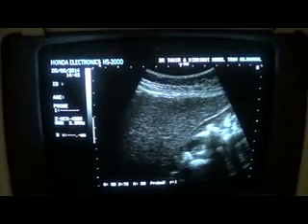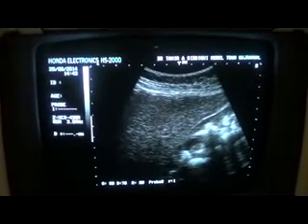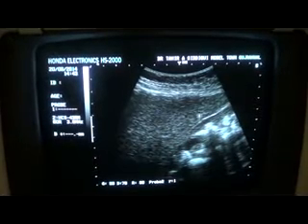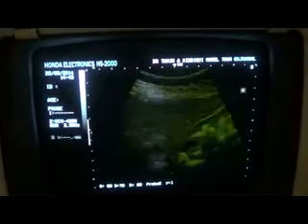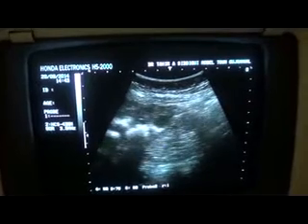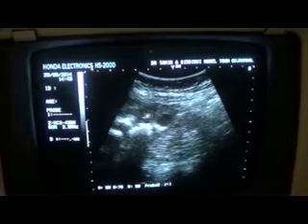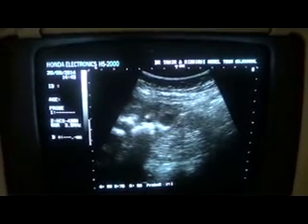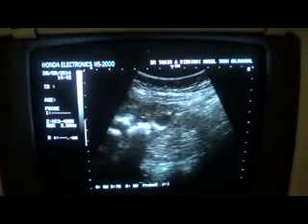This is the capsule, this is the cortex, and compared with the echogenicity of the normal liver, the echogenicity is slightly less as compared to the adjacent liver parenchyma. So this is the expected norm. The renal parenchyma is normal, and its thickness is preserved. This is the medulla. Remember, this is the medulla because you are seeing a tiny linear structure anterior to it. This is the arcuate vessel, and this is the cystic area.